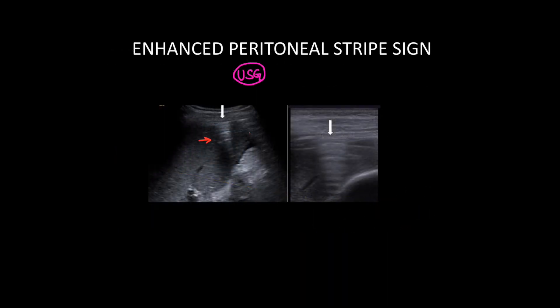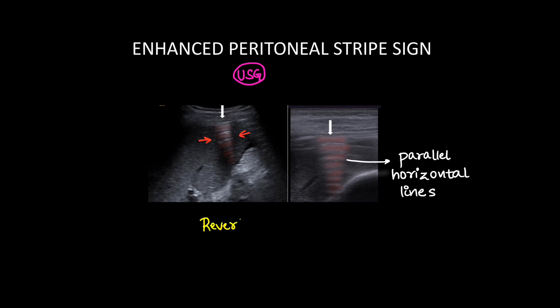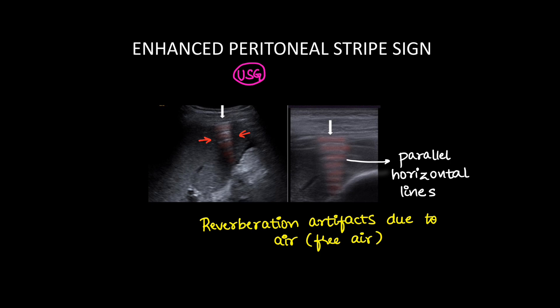That's all for the x-ray signs. Next we have a sign on ultrasound. We can see parallel horizontal echogenic lines just underneath the probe. This is because of free air collecting below the peritoneum, and these are reverberation artifacts due to the free air, known as the enhanced peritoneal stripe sign.